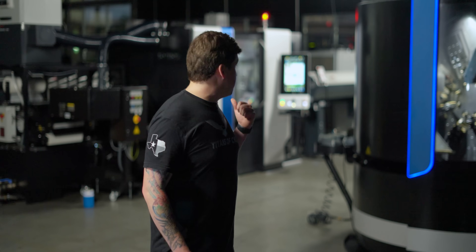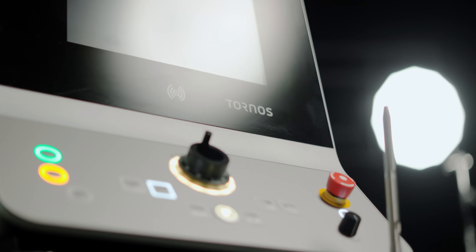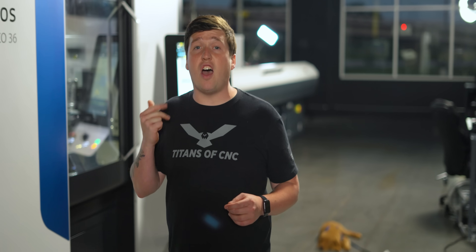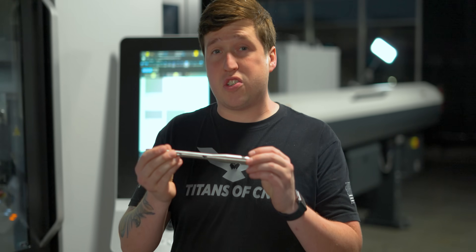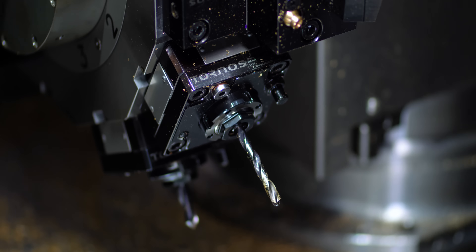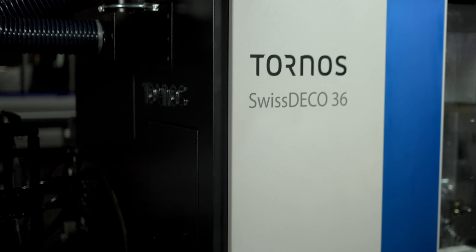Today I'm going to show you how this machine behind me is an absolute modern marvel. It is the most versatile, the most capable, the most technologically advanced machine of its kind. And it makes programming a part like this, which is used in hip surgery, actually really, really easy. So I'm excited to finally show you this machine and all of its capabilities. It's my favorite machine here at Titans of CNC, the Tornos Swiss Deco 36. Let's get into it.